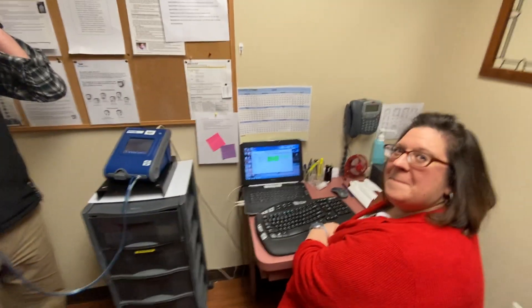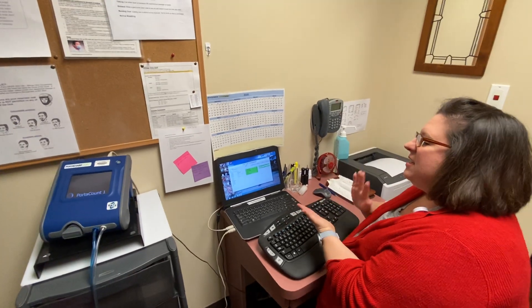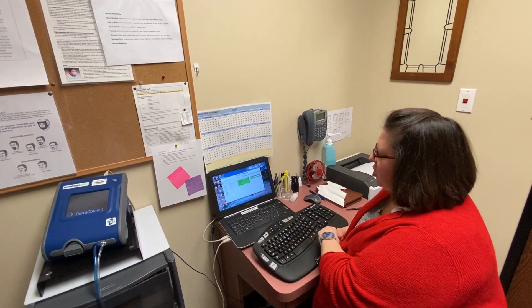Test complete, go ahead and pop the mask off. Sweet, we passed! So what can you tell us about the score? A score of 200 means that it's an excellent fit. It means that we're not seeing any particles coming through the mask, through the tubing, into the machine.